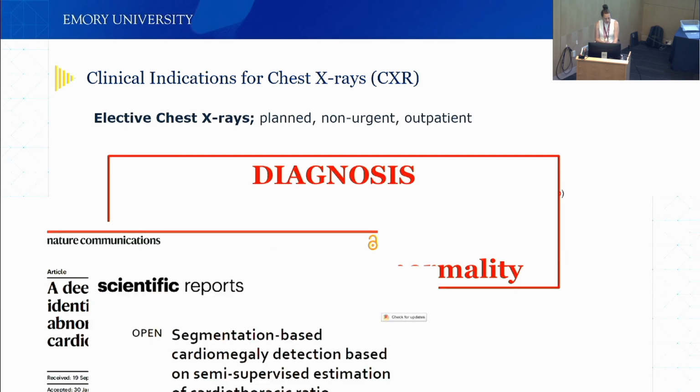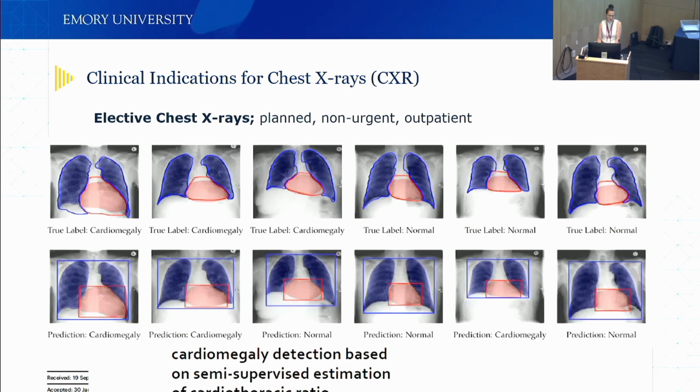There are some cardiac things. So this is based on if you have an enlarged heart. So what they do is they measure the lungs. So it's a fairly simple segmentation algorithm. You segment the lungs, segment the heart, and look at the ratio. If that ratio is larger, it's indicative of cardiac disease, especially the cardiomyopathies and heart failures.